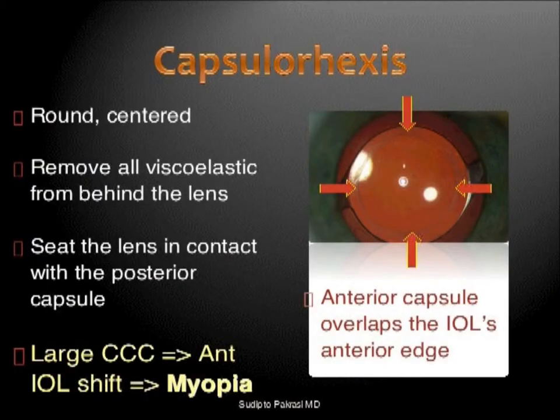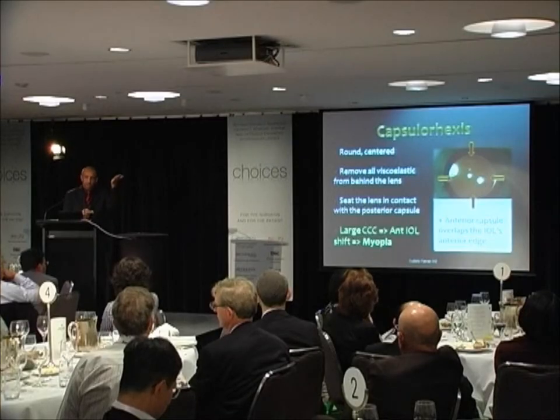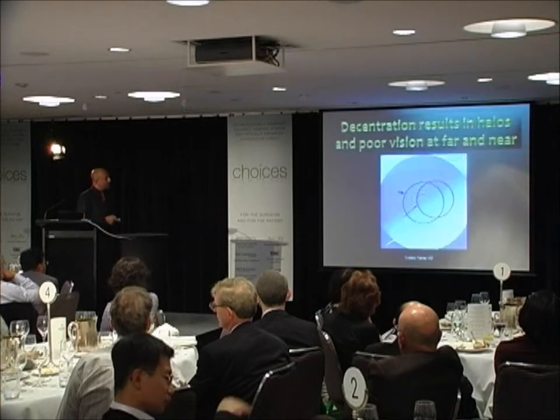During surgery, the rexis is an extremely important issue. The question here is a round, centered rexis, and the optic equally well covered by the rexis edge is very important. Otherwise, what may happen is there would be anterior shift of the lens after surgery in the post-op period. So you may get a patient who is perfectly corrected after surgery, probably the first week or the first month, and he comes back to you after 9 months with a -1. Why? Because the lens is shifted up. The shift of the lens is going to create some more myopia.